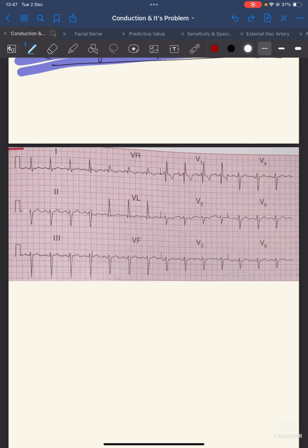Okay, here there is P, here is Q, here R, then here is S, then here is T. Then P, then here is the PR interval, then Q, R, S, T. So P, Q, R, S, T, P, Q, R, S, T. So it shows that it is normal too. Then I'll scan over the rest of the leads, and opposite to the 2, it must be inverted. There must be T wave inversion, P wave inversion. So I will see whether that is there or not. P, Q, R, S, T, they are inverted. So this is correct. I have just scanned two of them.